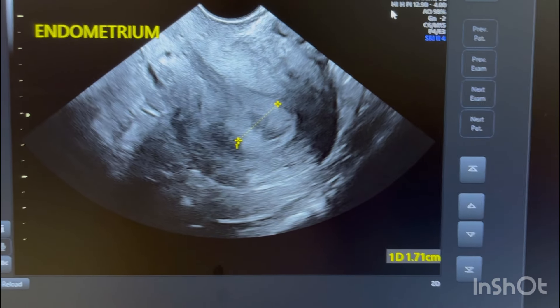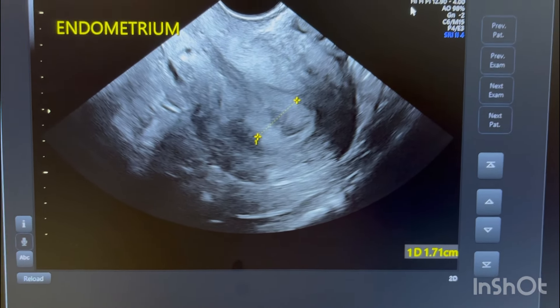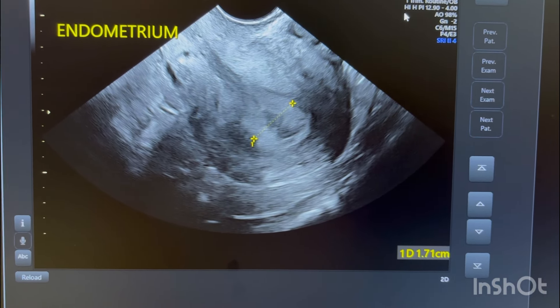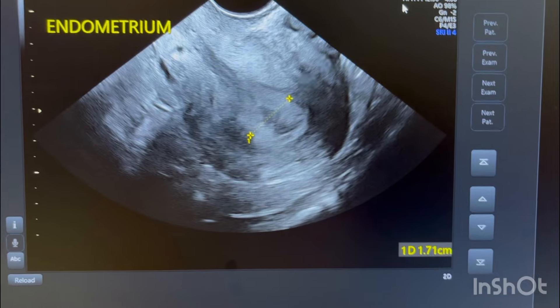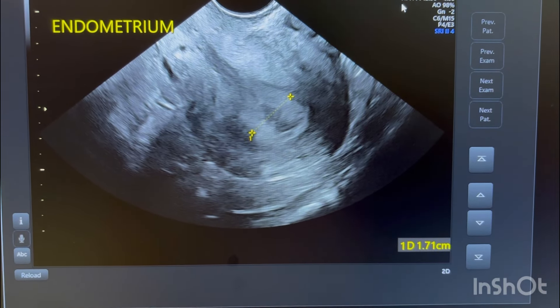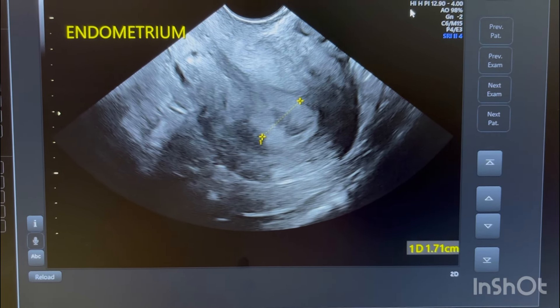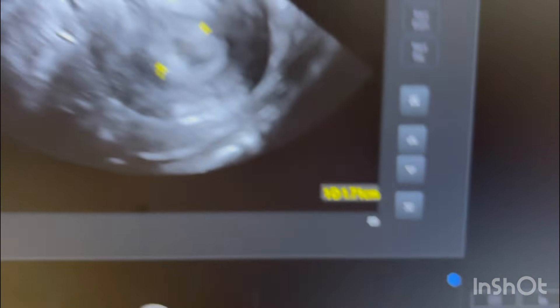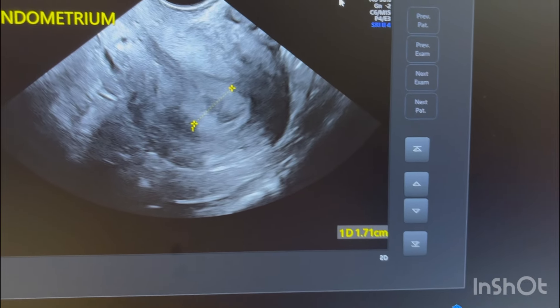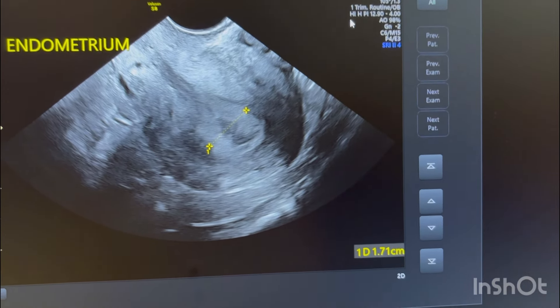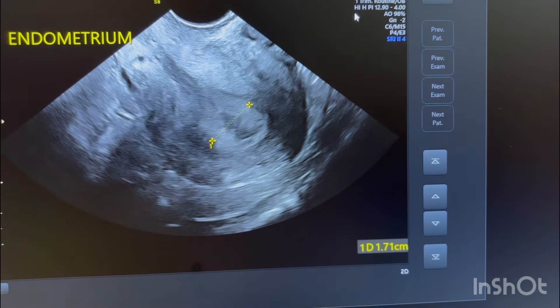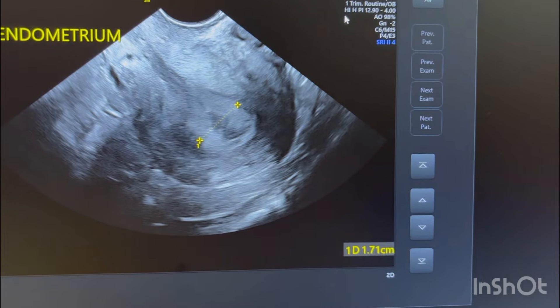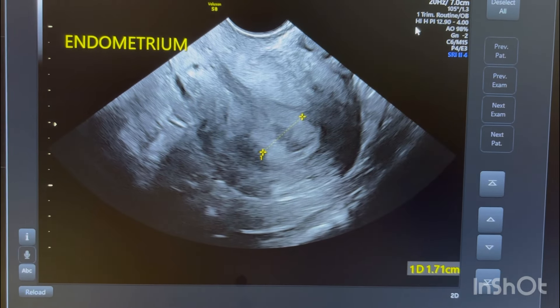Good morning everybody. This video shows a typical case of pelvic inflammatory disease with typical findings. The endometrium appears thickened at 17 mm, but this is not a true thickening — it is due to endometritis and some thick fluid or collection giving a false appearance of increased endometrial thickness.